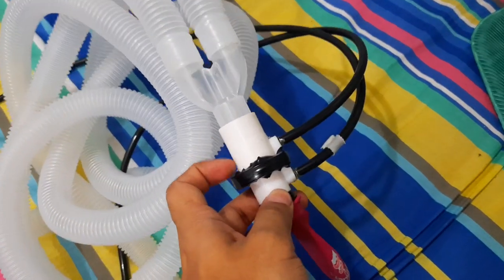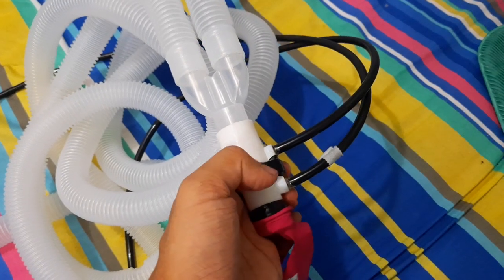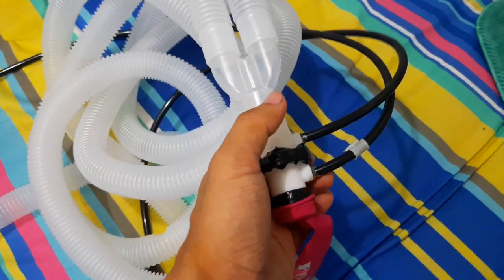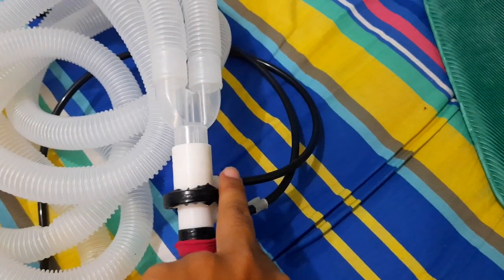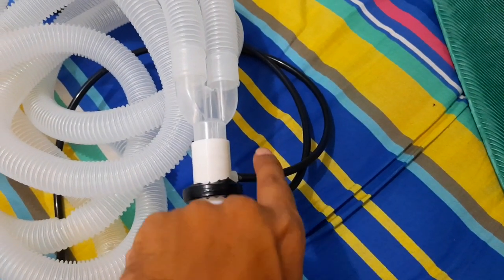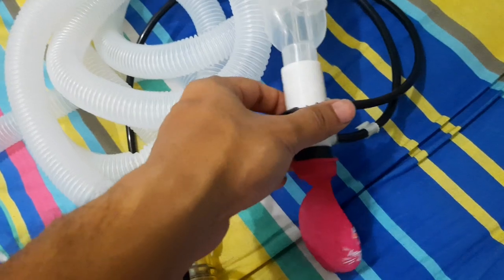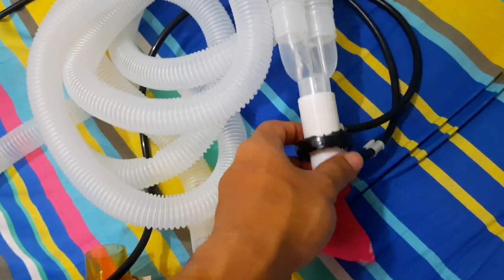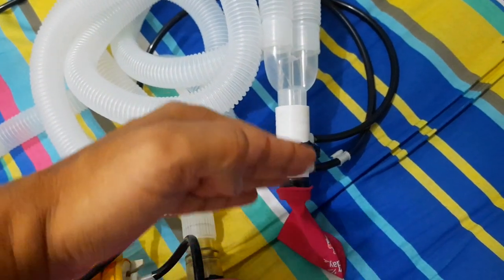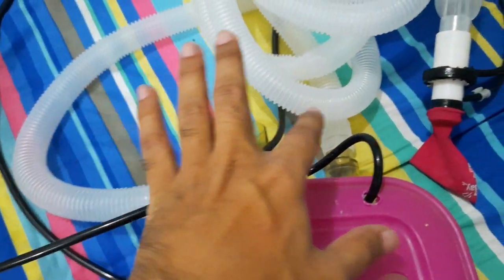This is basically an orifice tube that we have designed to measure air velocity, so that we can integrate over time and find the total volume that has been delivered. When air flows through these two lines, we find a pressure difference, and we convert this pressure difference to flow. When we find the flow rate, we can integrate and find the total volume. One advantage of this orifice tube is that it is bidirectional. Although both directions are not the same, we can manage it. This is the pressure circuit, and this is the PIP bulb and one-way valve.